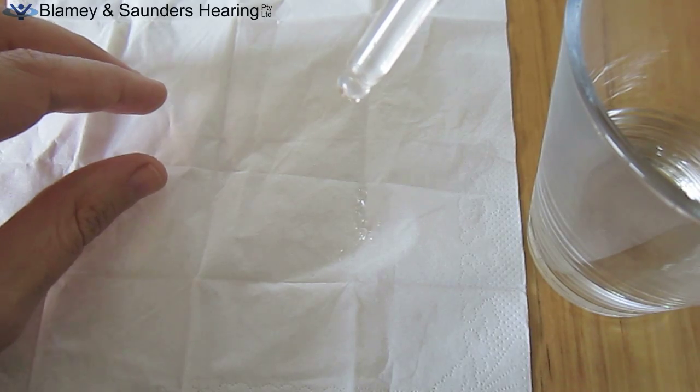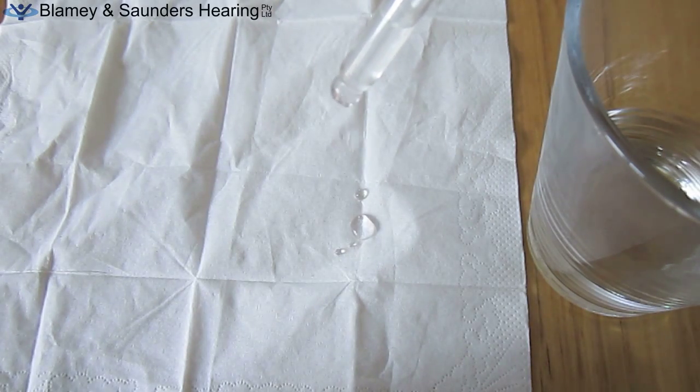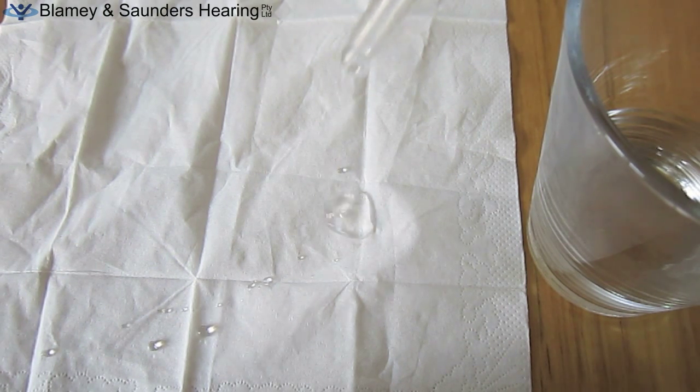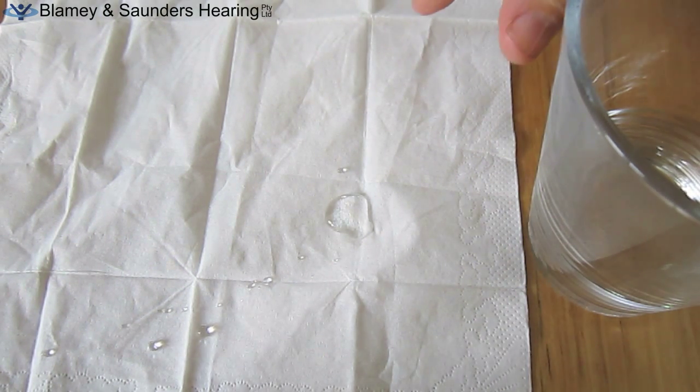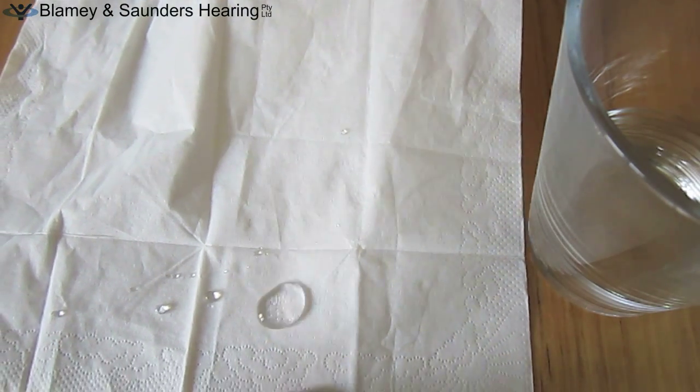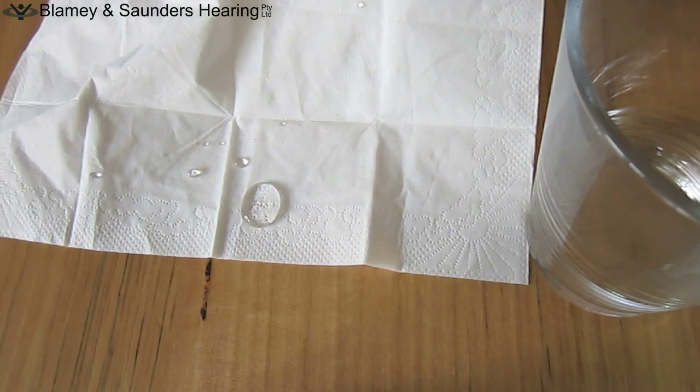Here is a normal tissue that was coated with the hydrophobic nano water repellent. This is a glass of tap water. We apply drops of the tap water onto the tissue using an eyedropper. As you can see, the water beads, and then when the tissue is lifted, the water runs off.